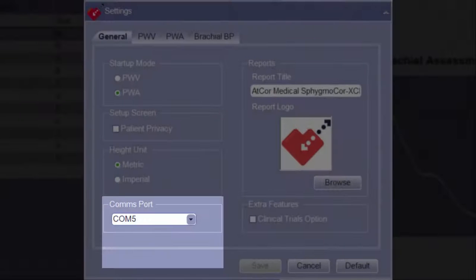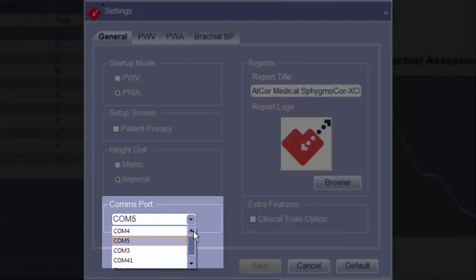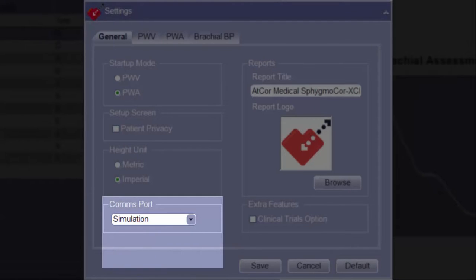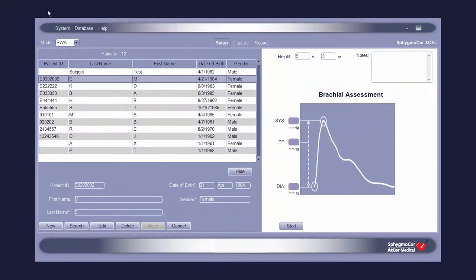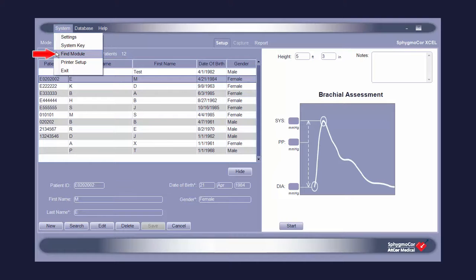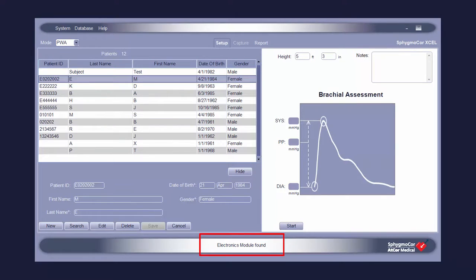The Comms Port option allows the user to select the communication port that the Spigma Core XL module is plugged into, and also allows for the selection of simulation mode. The correct communication port can be automatically selected by clicking System from the upper left menu and choosing Find Module from the drop-down menu. A notification on the bottom of the screen will confirm communication with the Spigma Core XL module and successful selection of the communication port.